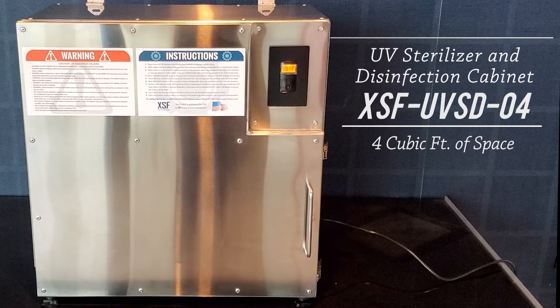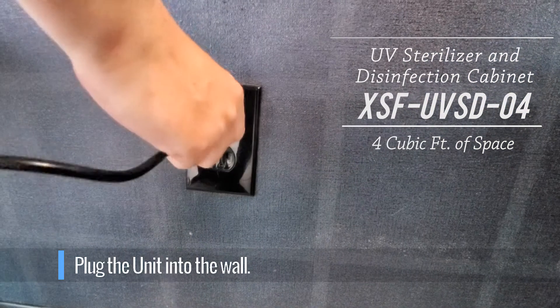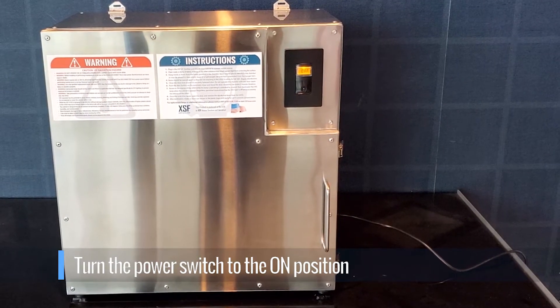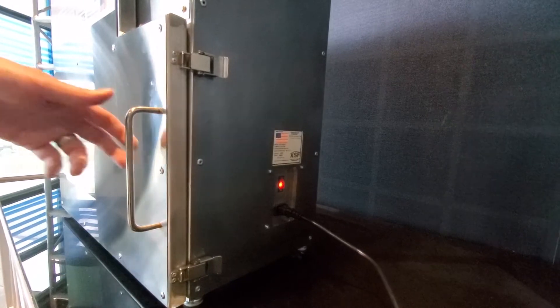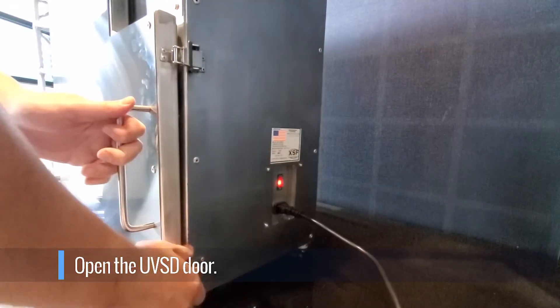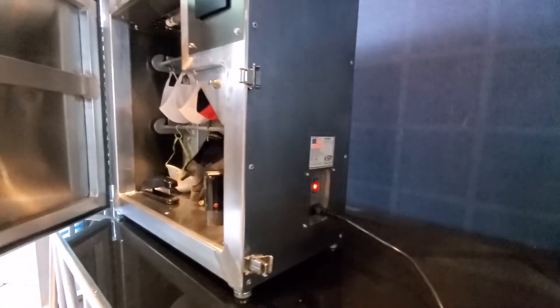To operate, plug the unit into the wall. Turn the power switch to the on position. Once the unit is plugged in and powered on, open the door by unfastening the two door latches on the side of the unit.